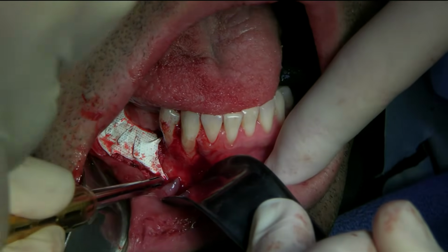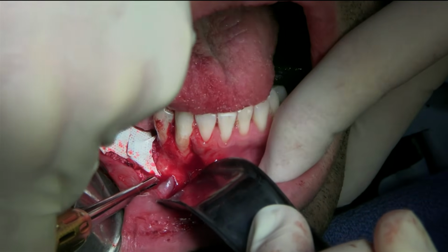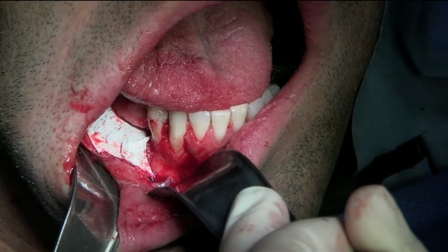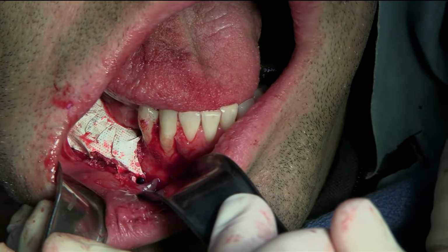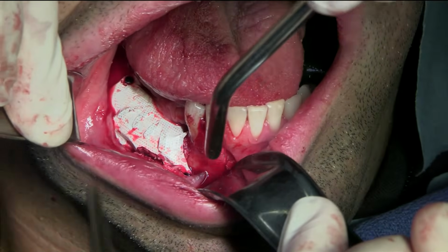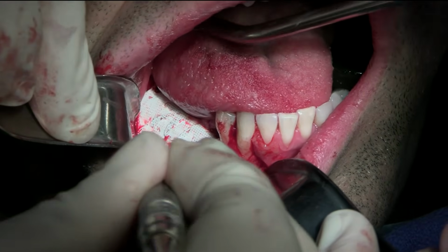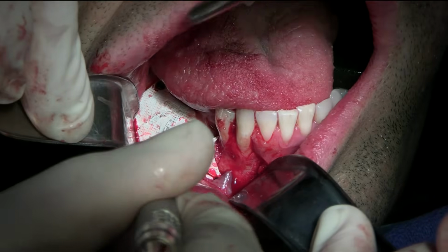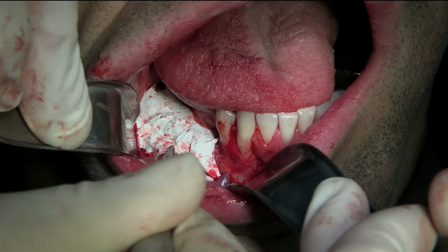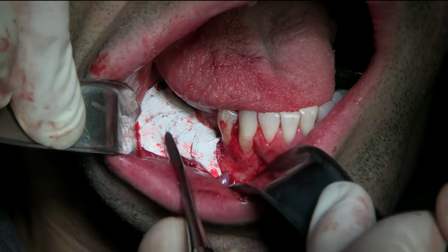Okay. Again, a little bit tapping. Tapping. Can I release? No. Okay, got it. Another tack? Or no? Okay, just checking in on the membrane. Yeah, we can do one more tack. Ready.